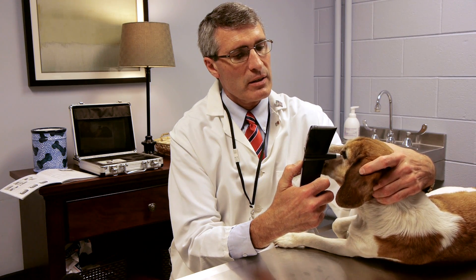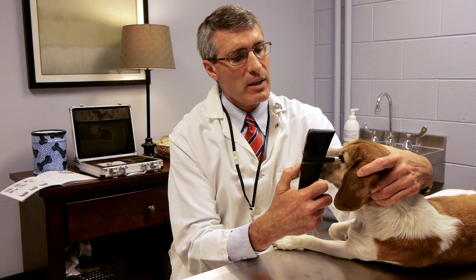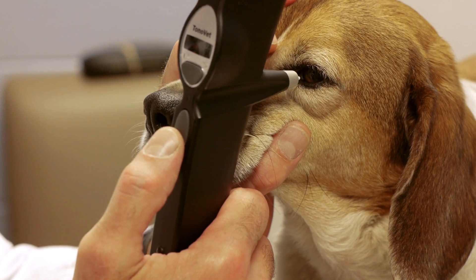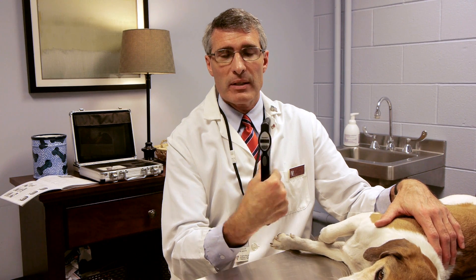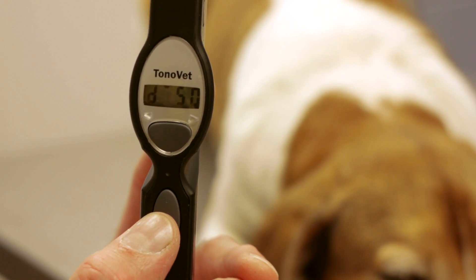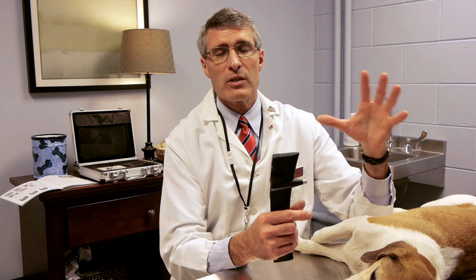You can see that the dog doesn't seem to be affected at all. Every time it takes a reading, you get a quick beep. Once it takes enough readings, these are averaged and you can read the result in the instrument. It gives you an error bar that allows you to determine whether or not the readings were precise, or if they were too erroneous and you need to repeat.